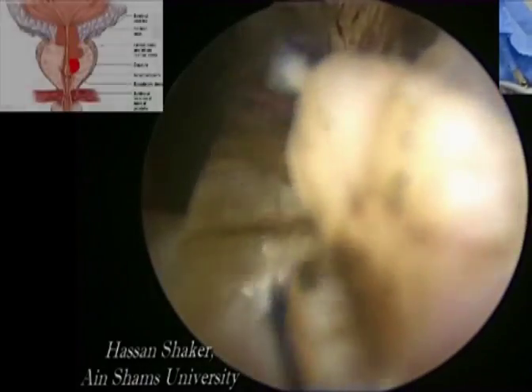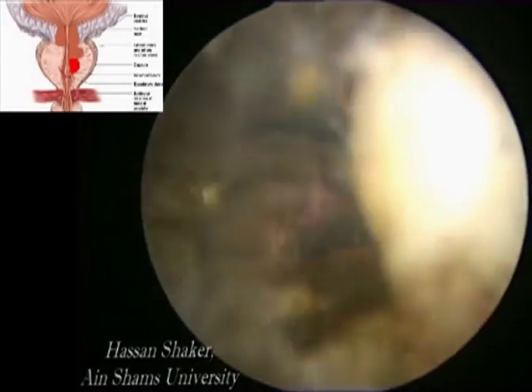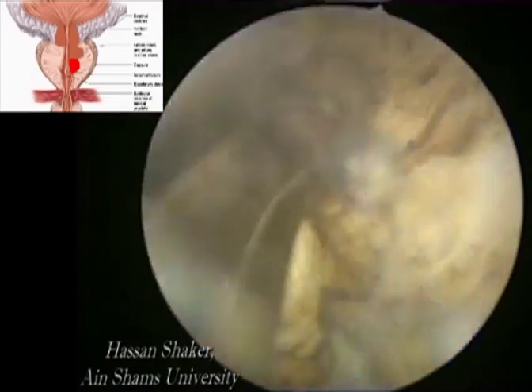Then we move to the distal half of the same lobe and ablation is done in layers again until the surgical capsule is reached.